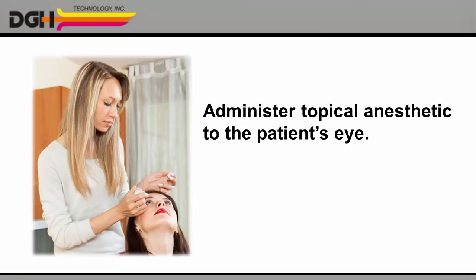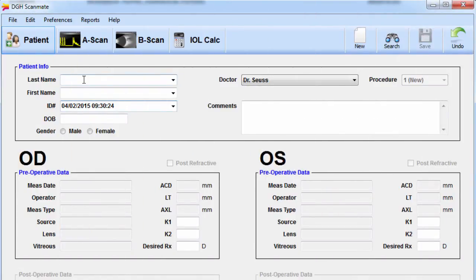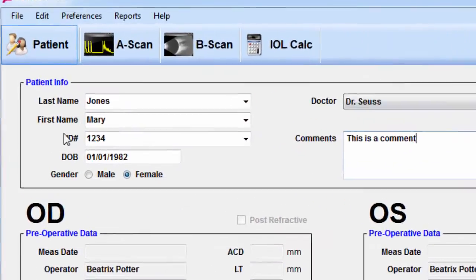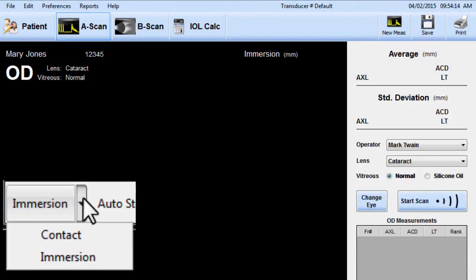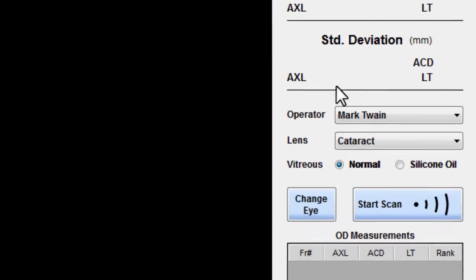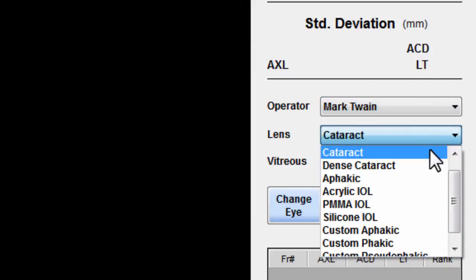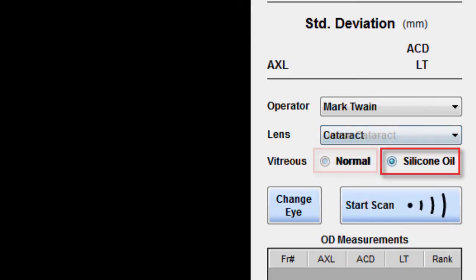Be sure to administer routine topical anesthetic to the patient's eye. When the anesthetic has taken effect and you're ready to begin the scan, just launch our ScanMate software and click on the Patient tab. Fill in the patient's name and other details, or search for a patient if you've entered them before. Be sure to click Save, and then move on to the A-Scan tab. Open the dropdown at the bottom of the screen and choose Immersion. On the right, specify which operator is performing this measurement. Select the patient's lens type — for instance, do they have a standard cataract or a dense cataract? And choose normal vitreous or silicone oil.